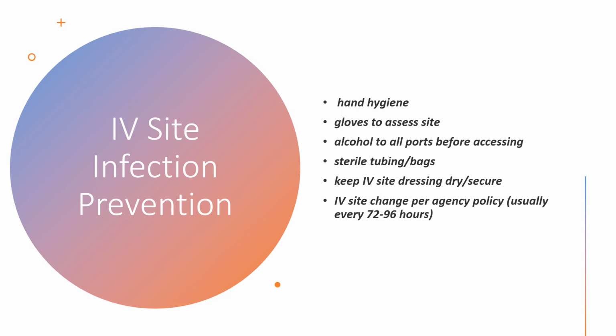Never leave ends of IV tubing uncovered. So you'll see in the clinical setting sometimes that people will disconnect an IV. If they disconnect an IV for any reason and do not put a sterile cap on it, we cannot use that IV tubing. So if we go in and we see that this IV tubing is left uncovered by another nurse, we cannot use it. We need to do a whole new setup for this patient.